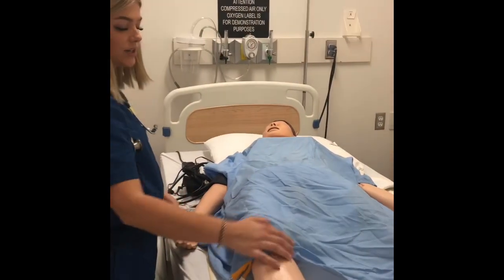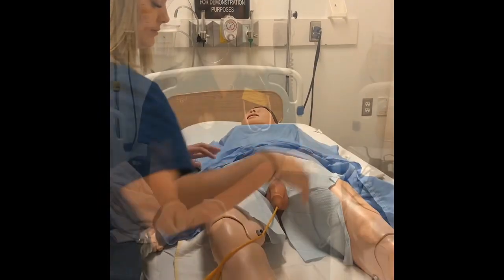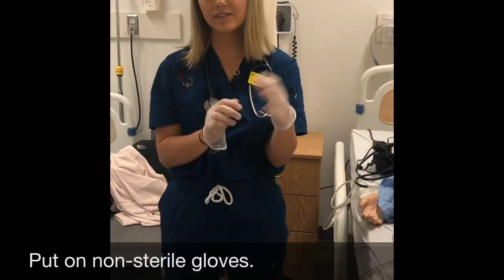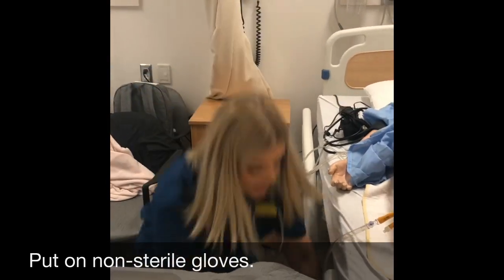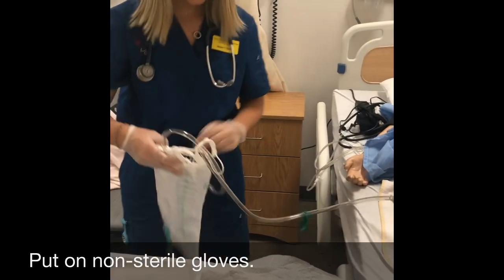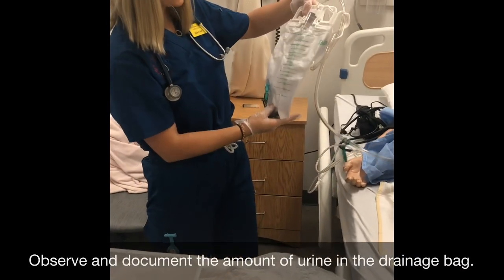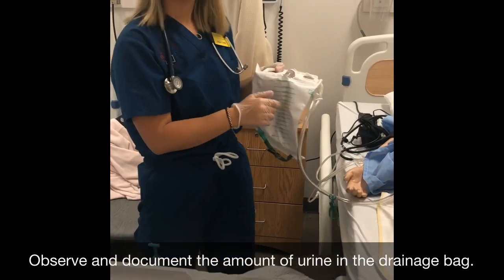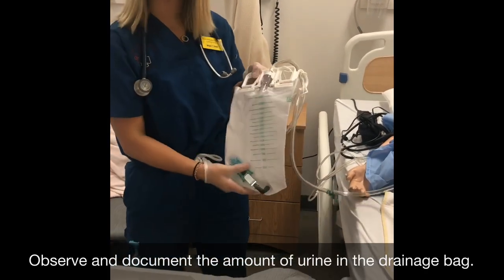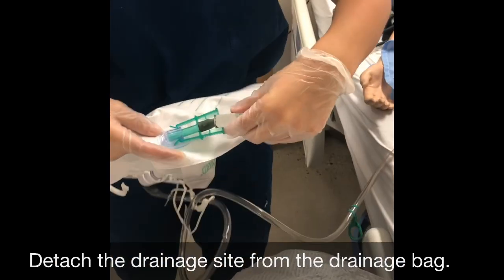So I'm just gonna raise your gown up a little bit. I'm gonna go ahead and put on my clean gloves, which I already have done, and I'm gonna empty the catheter bladder drainage bag. I'm gonna take it off the side rail, and pretend this is gonna be full. So right now I'm gonna look at it, and it is measuring 630 milliliters that Mr. Mancini has voided.